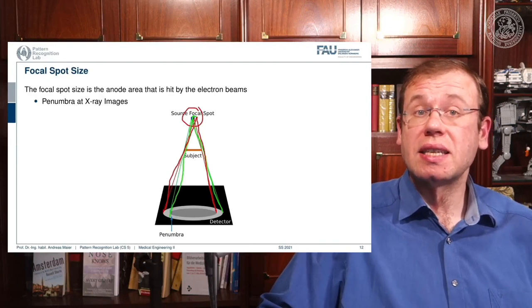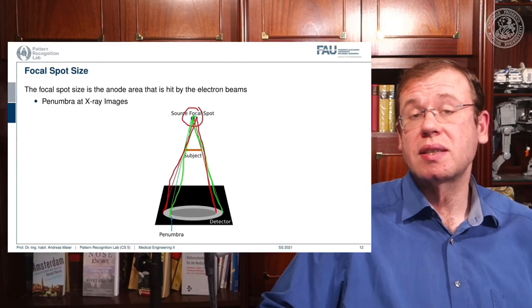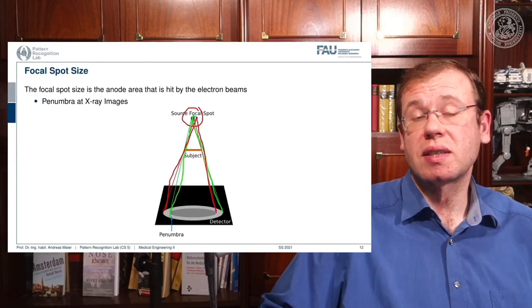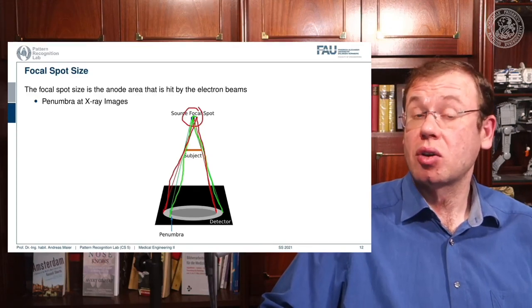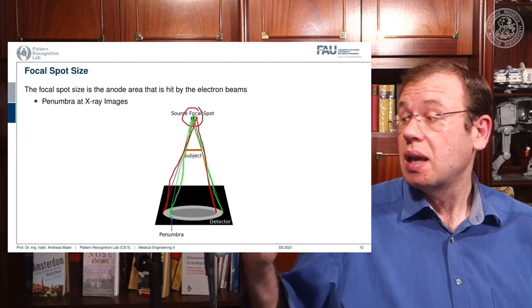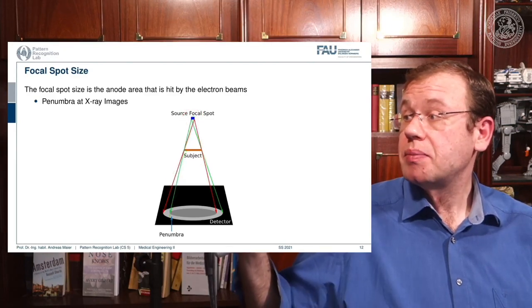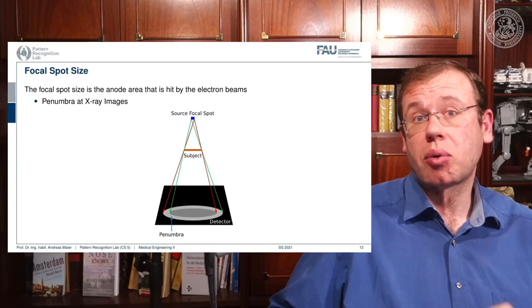We will see that we can also use this to derive a formula that allows us to determine the resolution of the system, but this is something that we will introduce when we talk about computed tomography and how to get 3D volumes from that. Now, if we do that, then we can understand that a small focal spot is really important.